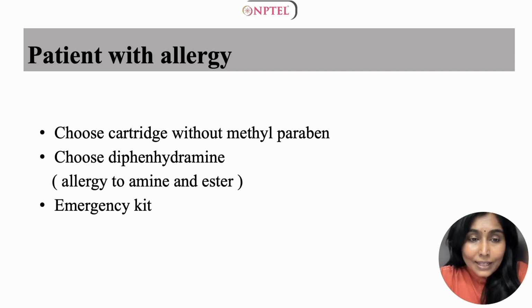And the last is the most important aspect that all of us need to follow. An emergency kit must always be ready to use in a dental clinic because complications are totally unpredictable. Let's be prepared.